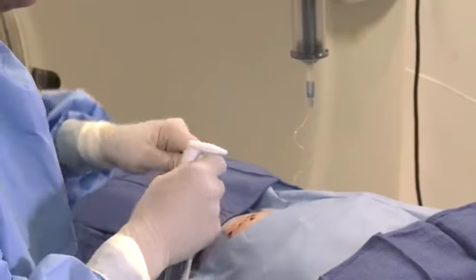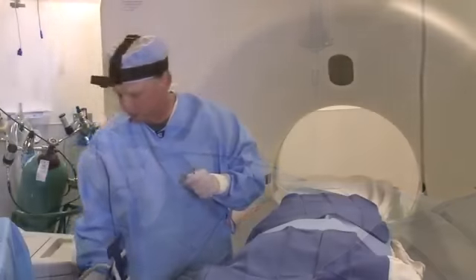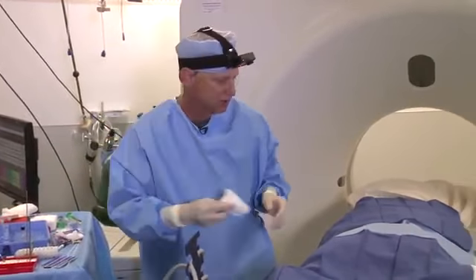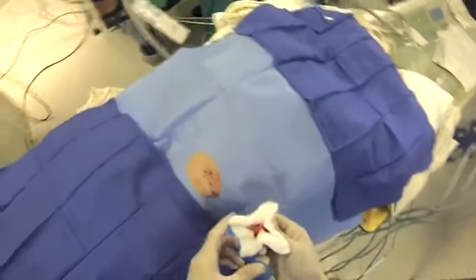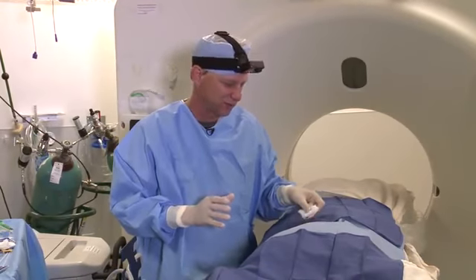So this guy's got 4 little nicks in his back, which we can cover with a single dressing. He'll spend the night in the hospital for observation and go home tomorrow with very little, if any, discomfort. Many times the next day people go, "Are you sure you did something?"